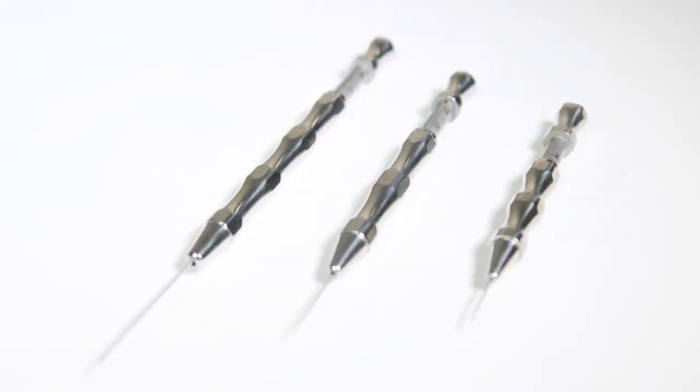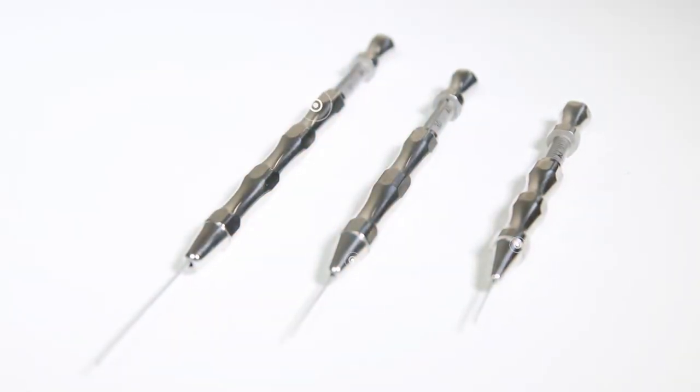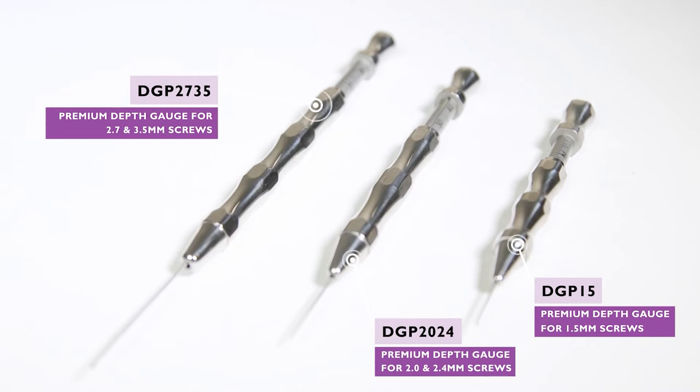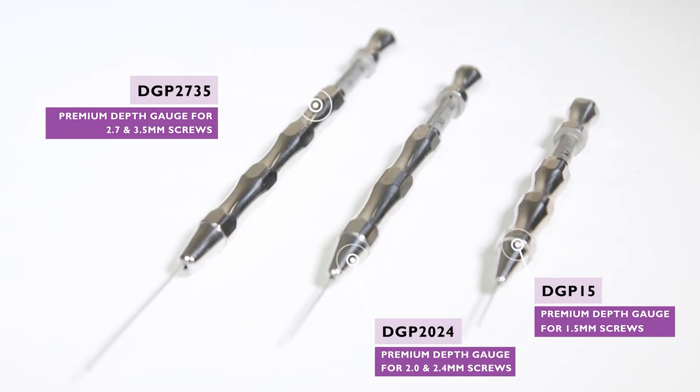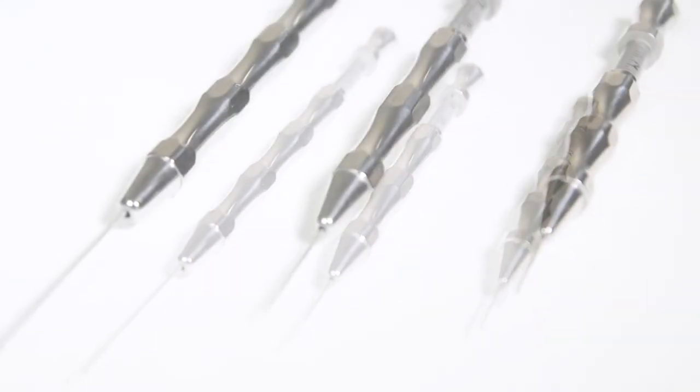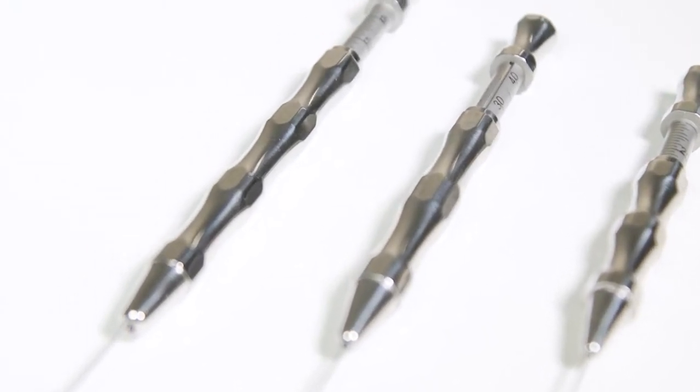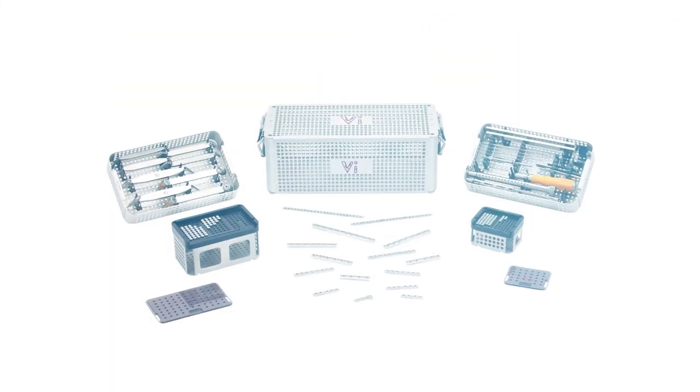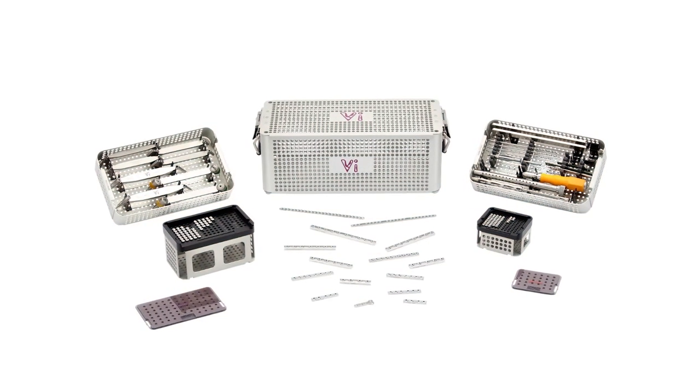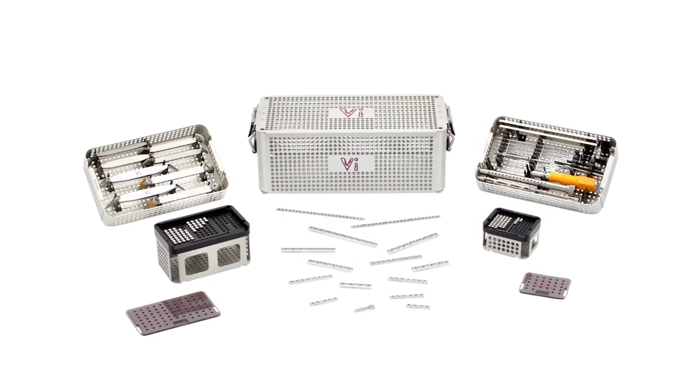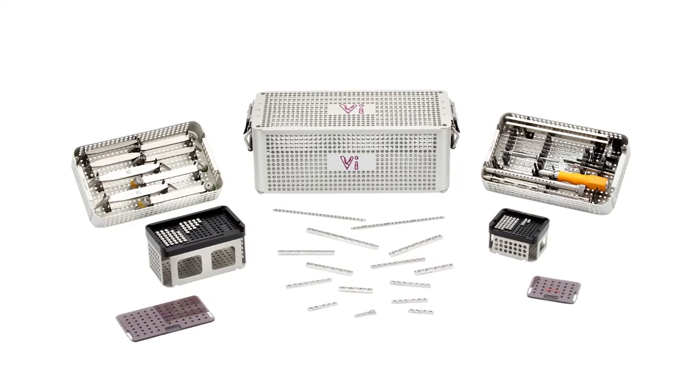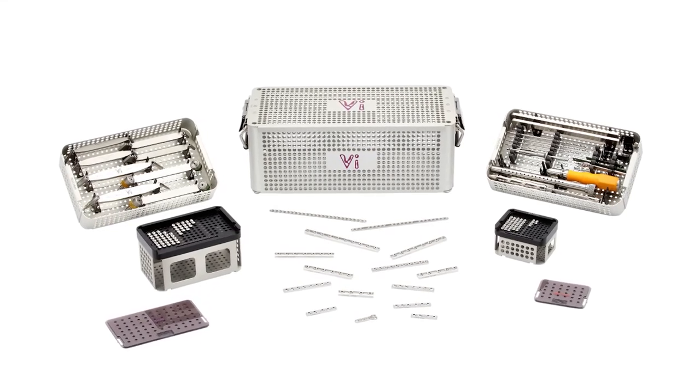VI supply a range of depth gauges. Here we see the premium range available from VI. These devices are size specific, according to the size of implant being used. Cortical plating kits are supplied with the appropriate size depth gauge as a standard component of the kit, but they are also available separately.